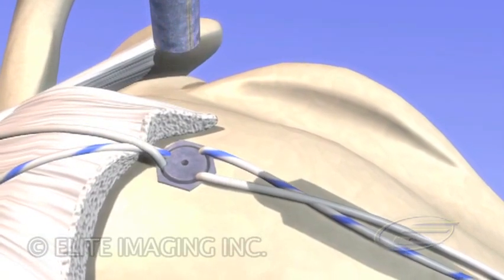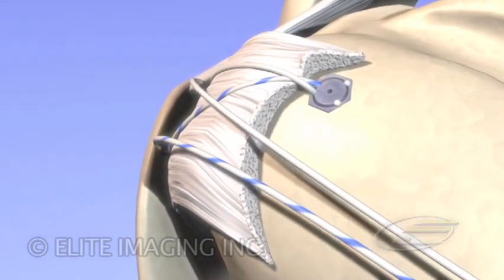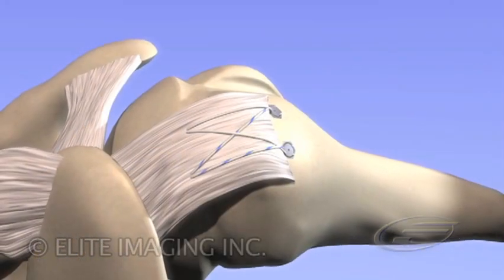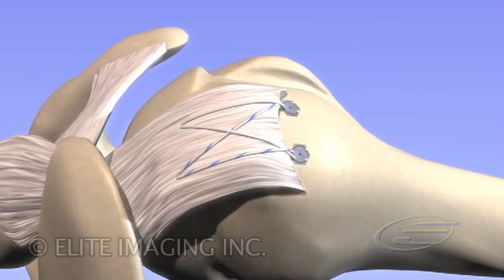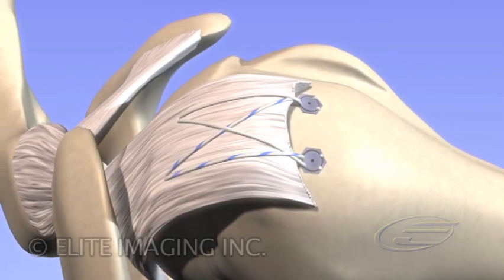To complete the second point of lateral fixation, the remaining sutures are moved into position. A second anchor is seated into bone, and the sutures are locked in place, creating a rotator cuff repair reinforced with 2 points and 2 rows of fixation that reproduces the natural anatomic footprint.